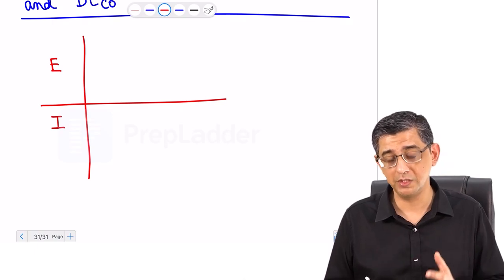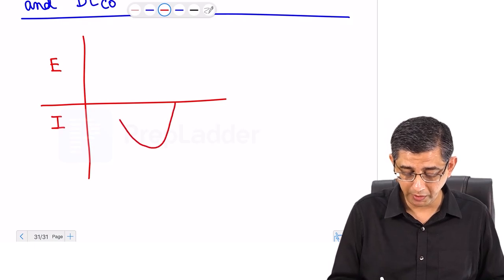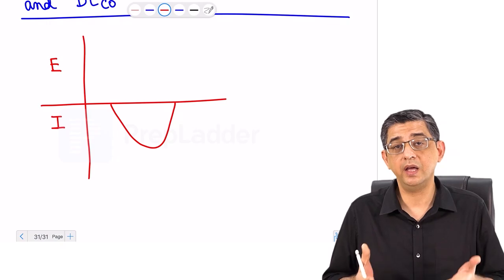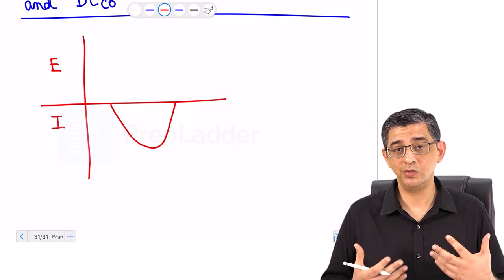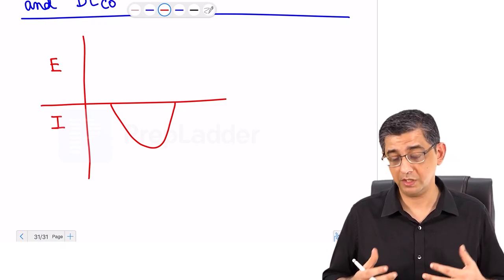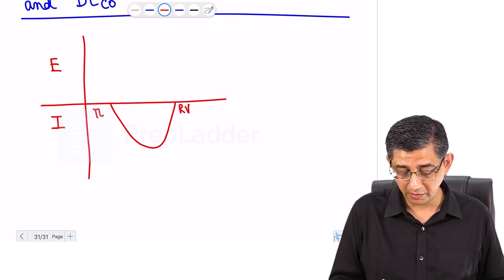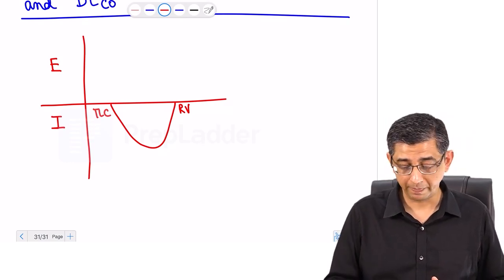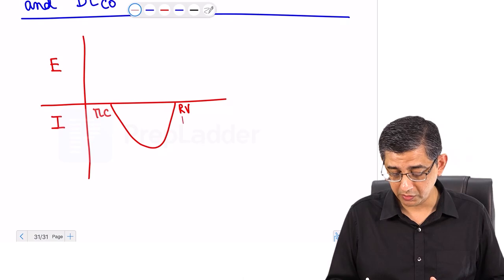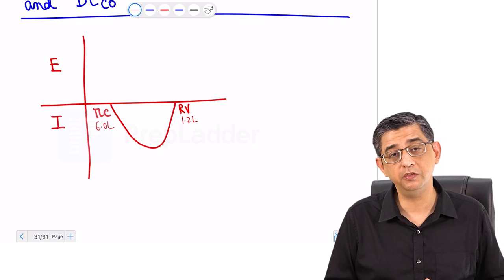I'm going to ask my patient to do some practice breathing, and then when he breathes into the mouthpiece, this is the kind of recording that I will get when I instruct my patient to breathe in as hard as he can. My advice would be breathe in as much as you can using all the power of your chest muscles. I'm noticing that my patient is filling air in his lung and is going up from residual volume to total lung capacity. If I look at the mathematics here, residual volume would be approximately 1.2 liters and TLC will be approximately 6 liters.